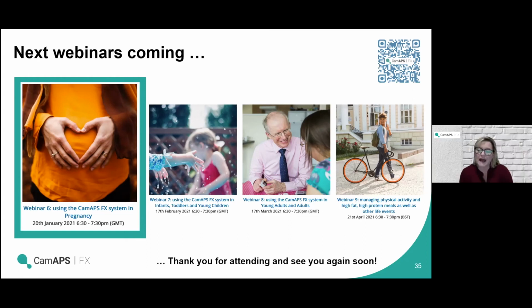So next question, at what point would you take hypo treatment? There's a scenario given. Let's say blood glucose levels are 4.2. The algorithm may well have pulled things back. Should you take a small amount of glucose at that point, or should you wait and see what the system's doing and whether it will bring you back up?